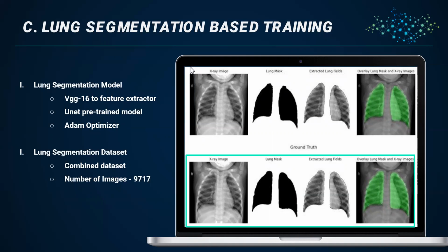In this way, we took advantage of the ImageNet pre-trained VGG16 feature extractor. The model was optimized using the Adam algorithm with default parameters. Various datasets are combined for the lung segmentation task. The reason behind it was that lung segmented images are not that common. Details of these datasets can be found in the report.